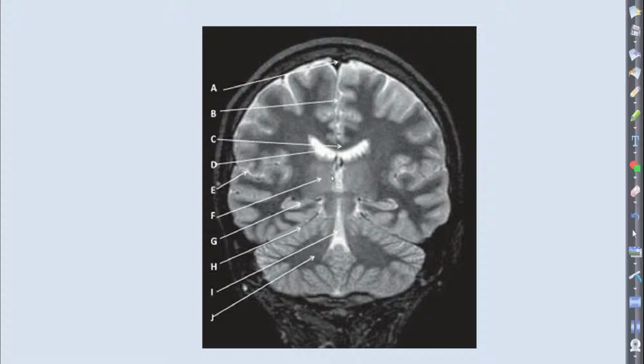Lies right up against that corpus callosum. We've already talked about that. Area where a lot of stroke. Thalamus, good. G, this is our hippocampus. So this is really important when we're imaging patients that have epilepsy. We want to see that hippocampus in profile. So we actually angle our slices 90 degrees from the hippocampus to get coronals so we can see the temporal lobes with the hippocampus in view. The hippocampus, part of the temporal lobe.